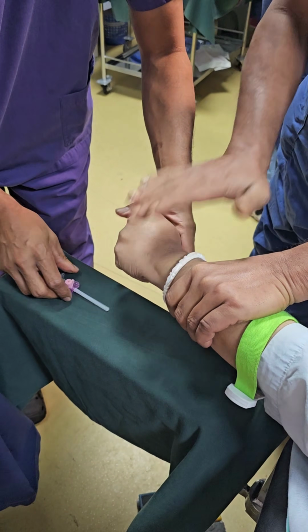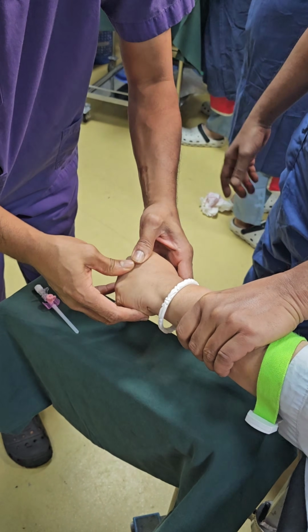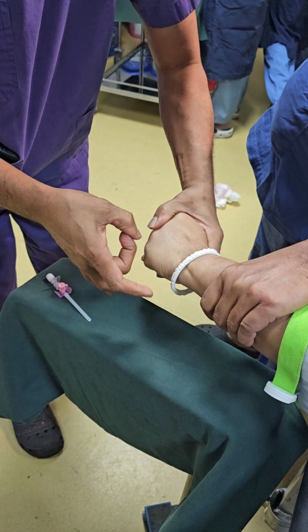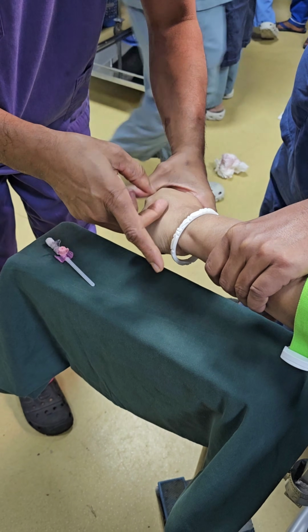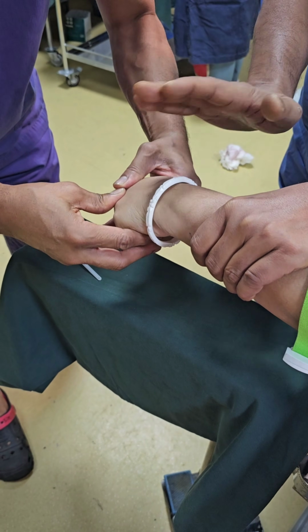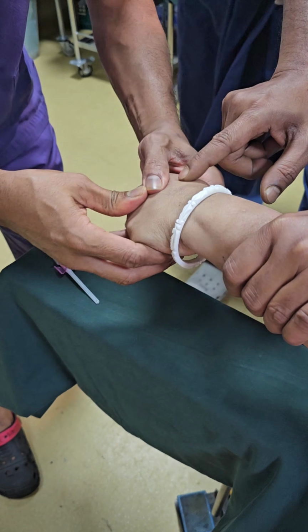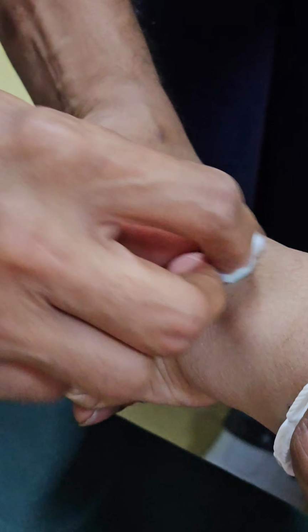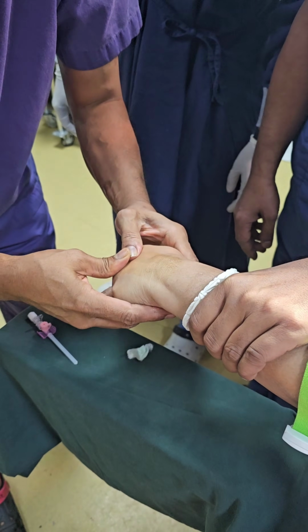At first we are trying to establish a secure channel, and you are seeing how difficult it is to find a vein in the dorsum of the hand of this patient. As she is a female patient, she has very narrow veins in her periphery, so we are trying to find one. We are tapping her dorsum, but we are not seeing any vein which can be cannulated.